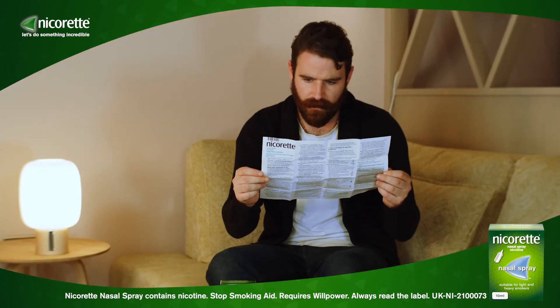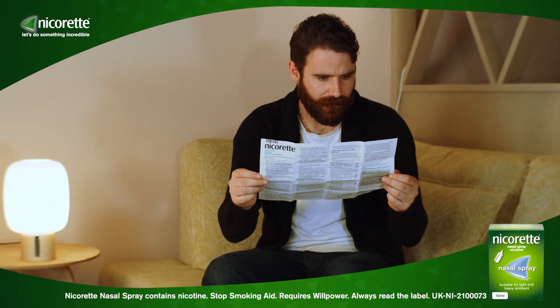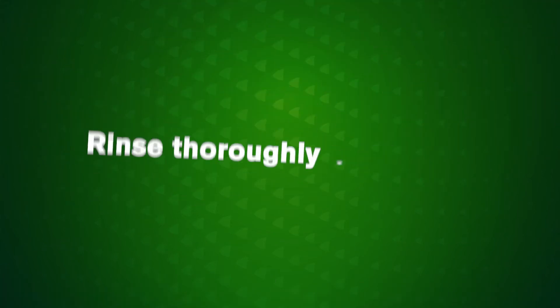Follow the instructions and study the pictures to ensure that you hold the bottle at the correct angle and use Nicorette nasal spray correctly. Care should be taken not to spray the eyes whilst administering Nicorette nasal spray. If the eyes are sprayed, rinse thoroughly with water.